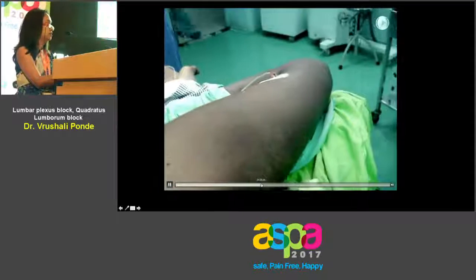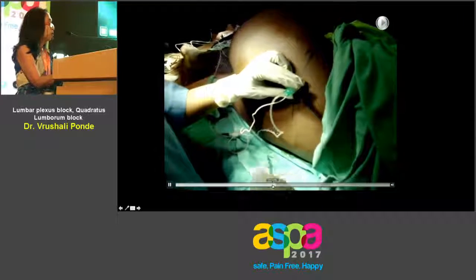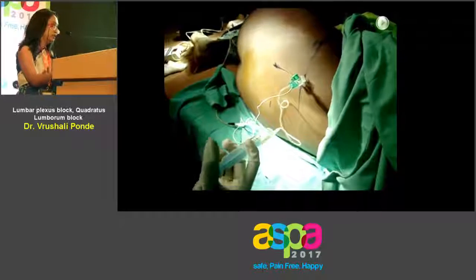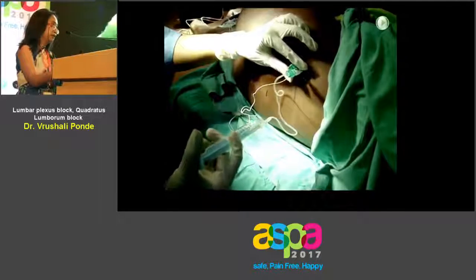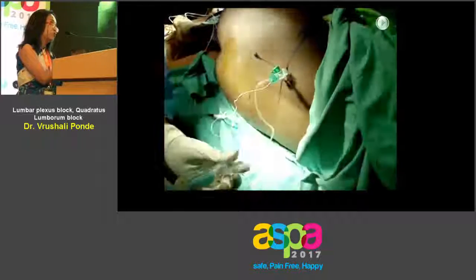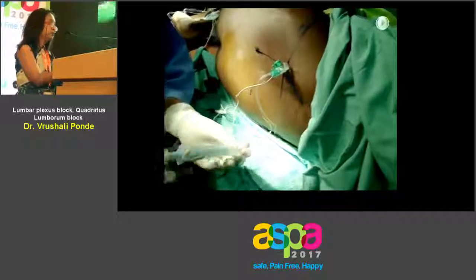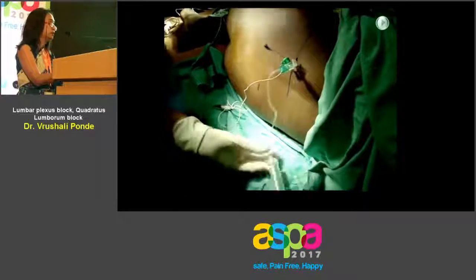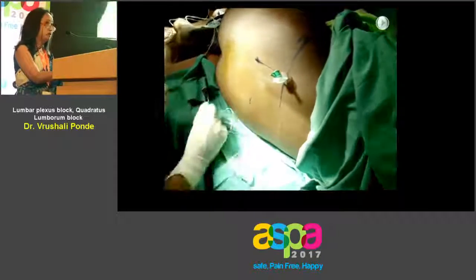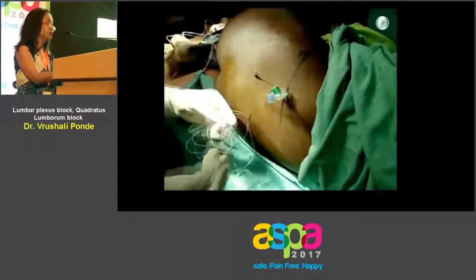Through this, the catheter is inserted. A practical tip here is, if we could dilate the space by half of the local anesthetic dose, it helps in inserting the catheter, number one. Number two, by that time, the block starts acting because this takes its own time to act. Plexus blocks need time to act. If you are in the right plane and the right place, and the tissue dissection has happened well enough, the catheter passage is pretty smooth.